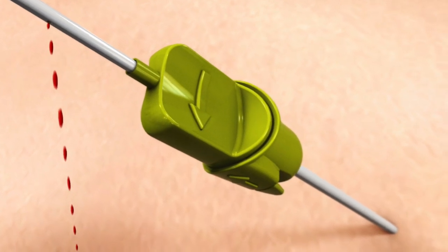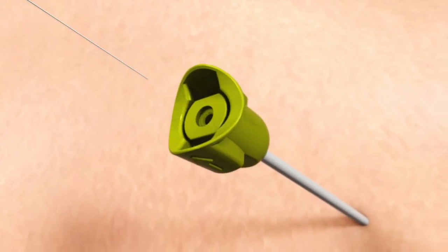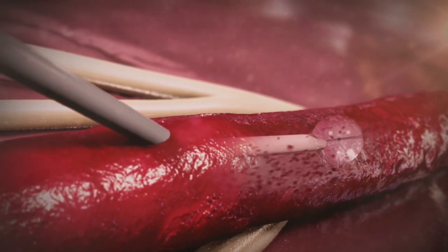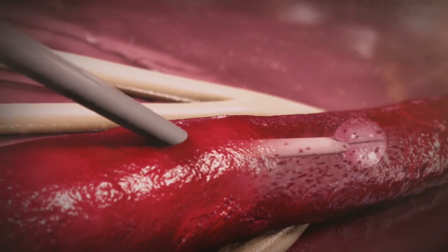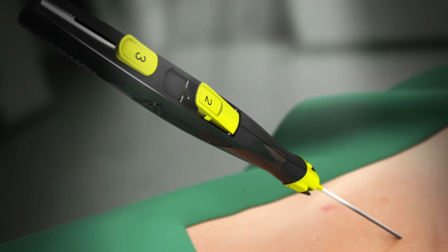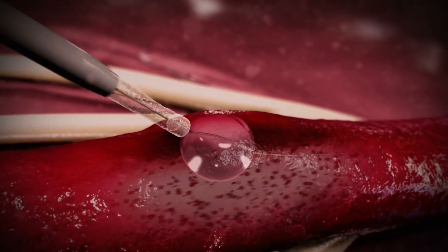The MinxAce is positioned in close proximity to the arteriotomy. The semi-compliant balloon provides temporary hemostasis. Sealant is placed gently on the arteriotomy.